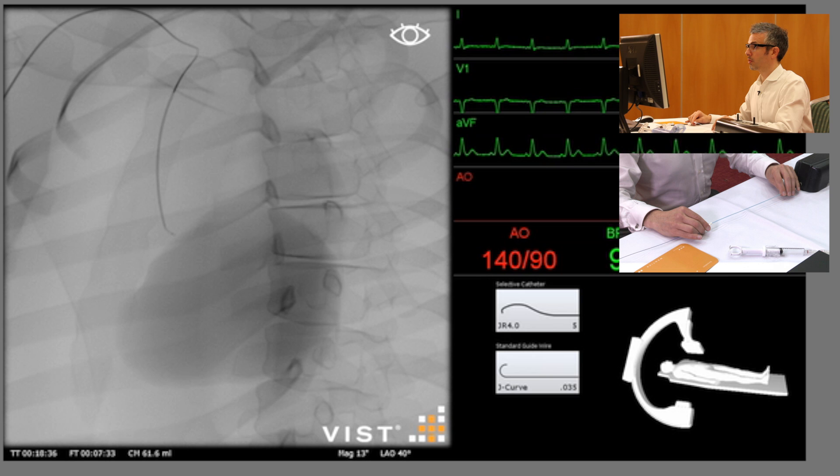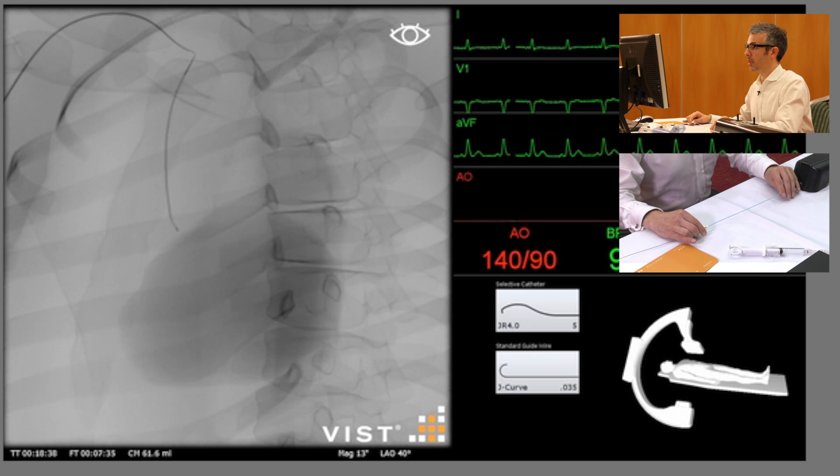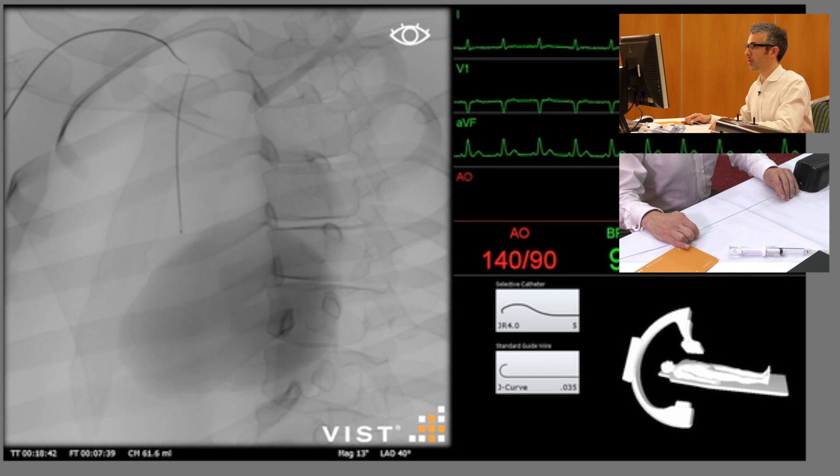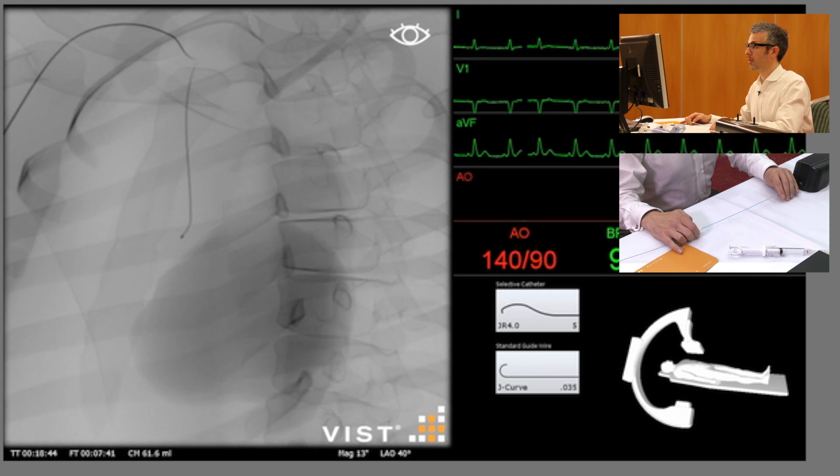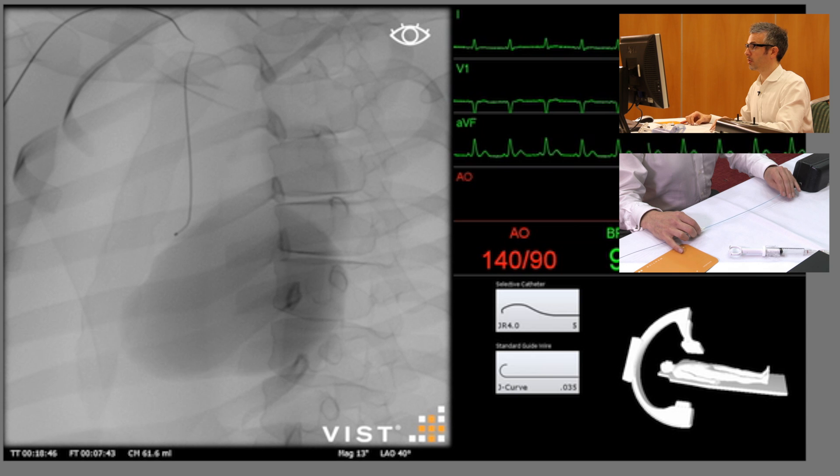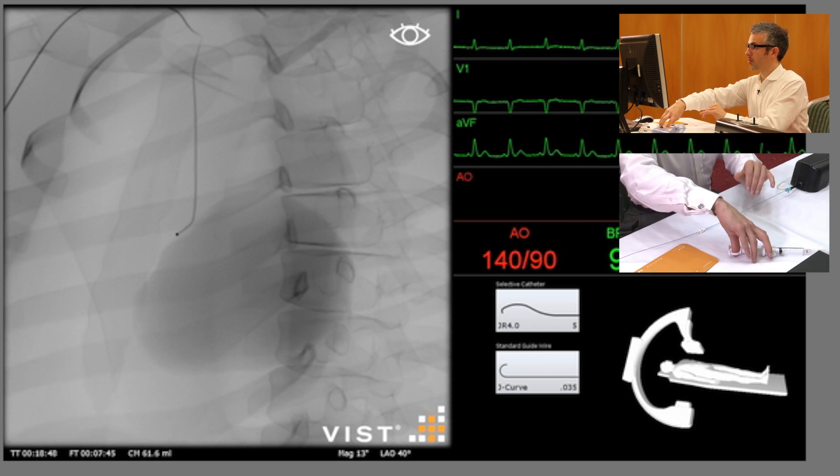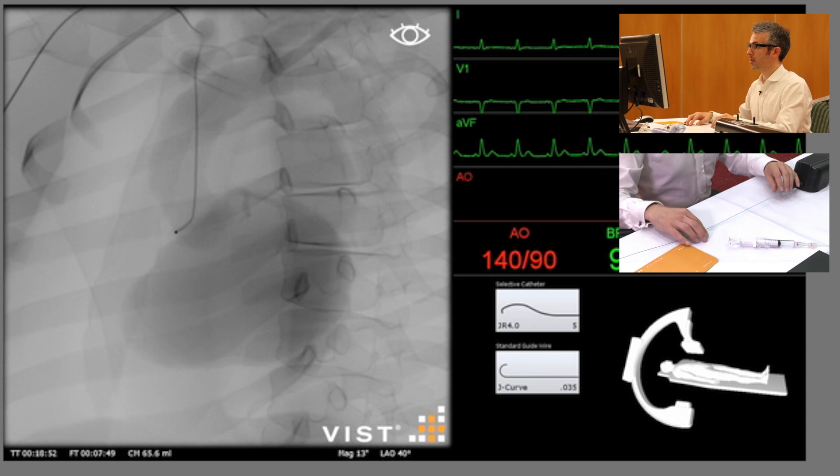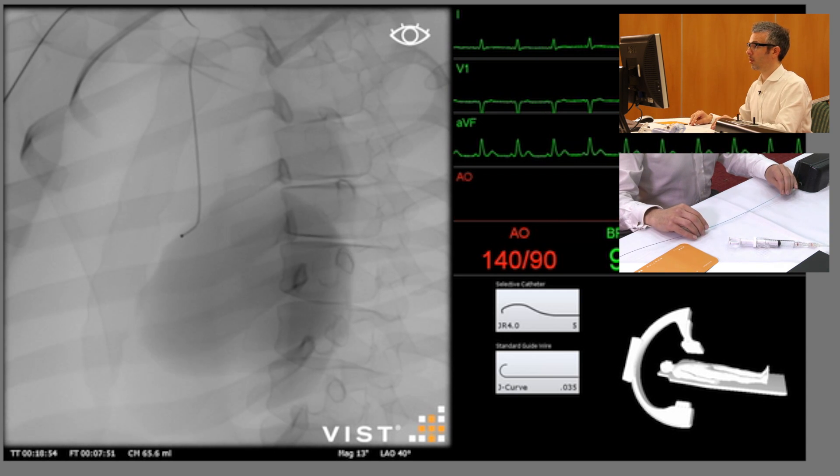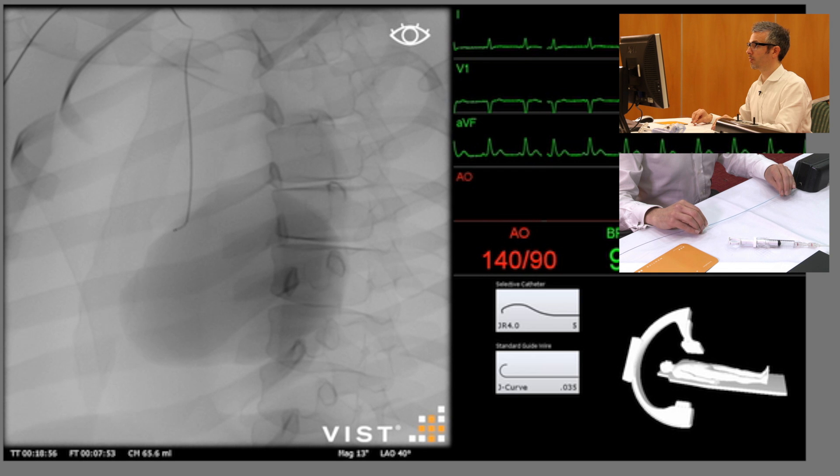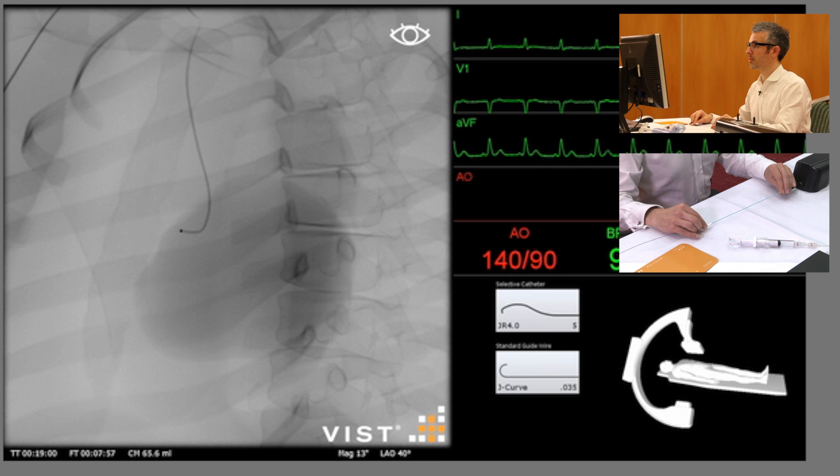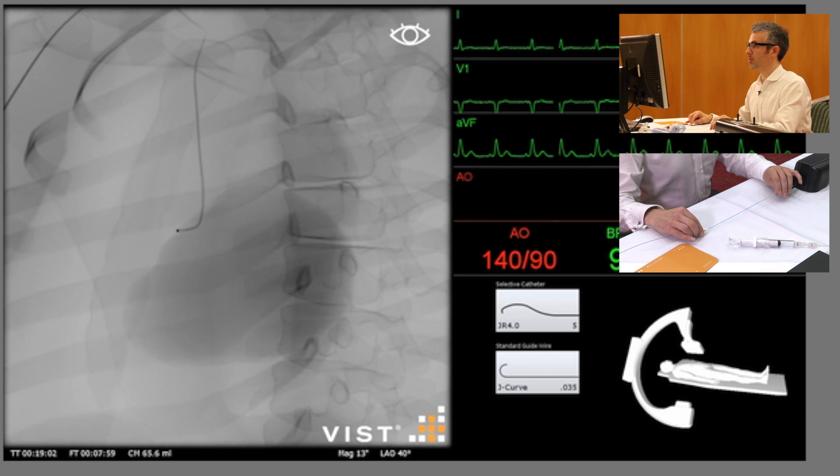So we're just going to gently torque our catheter around towards the left-hand side of the screen towards the right coronary ostium. We're looking to see a characteristic jump. Just take a small test shot here after looking at my pressure tracing. You can see we're not quite in the ostium yet. I'm just going to have to try a few little other manipulations to see whether we can get the catheter to sit just in the ostium as we want.